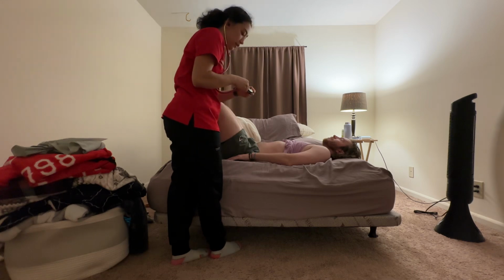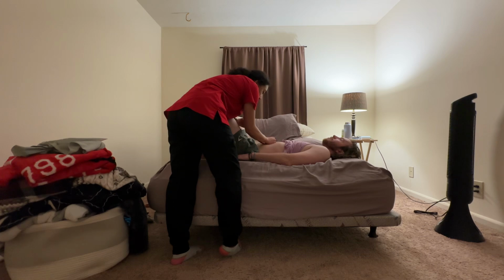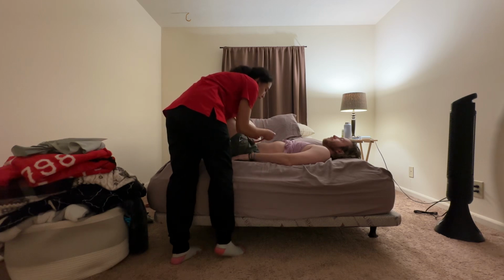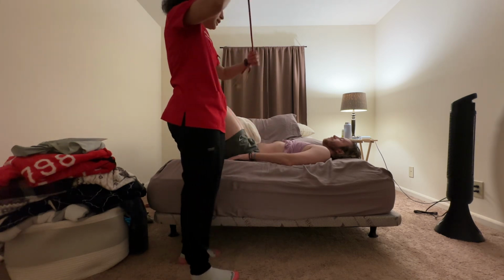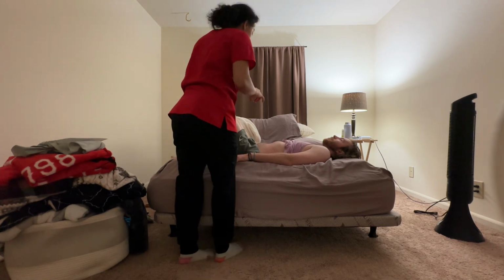I'm going to use the diaphragm first, and I'm going to do it in all 4 quadrants, starting at the lower right, and then upper right, and then upper left, and then down to the lower left. And then I'm going to switch to the bell side to listen for any bruit 2 inches above the umbilicus. All right. All 4 quadrants, bowel sounds were heard, no bruit detected.